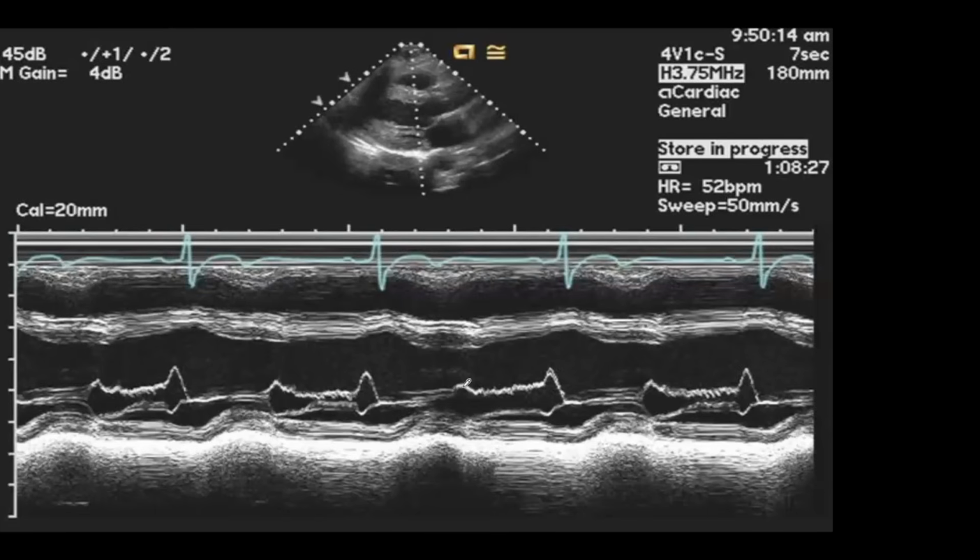So for this one, you cannot tell the degree of severity. It is just the jet. The jet is hitting eccentrically and going. And if you can see the leaflet here, it's a bit bowing like that. You see it, I don't know if it's clear or not. It's a bit bowing because of the jet. It does not indicate the severity. People will always fall for this one and say severe AI.